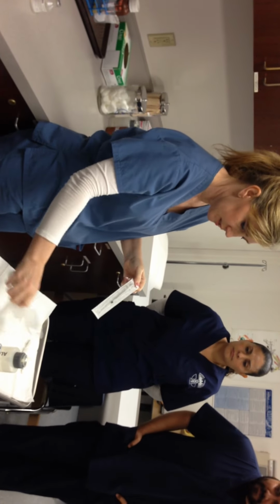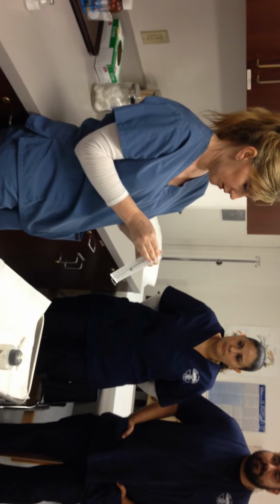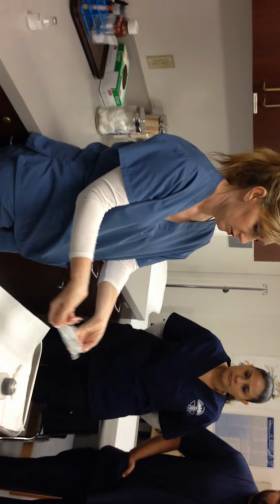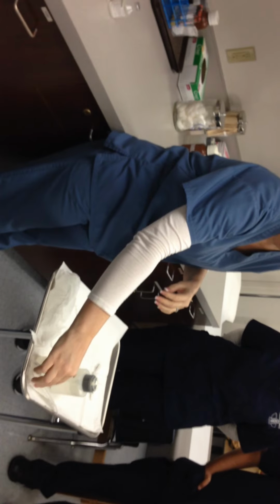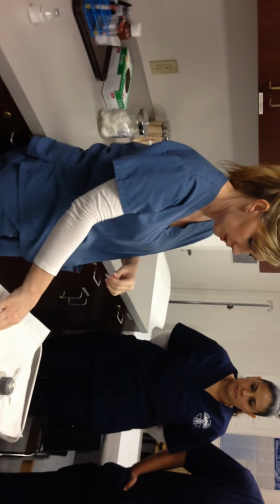And when I open this, remember how I showed you guys? Drop it onto your tray, okay? So I can set this over here in my dirty area because it's done. We don't need it anymore.